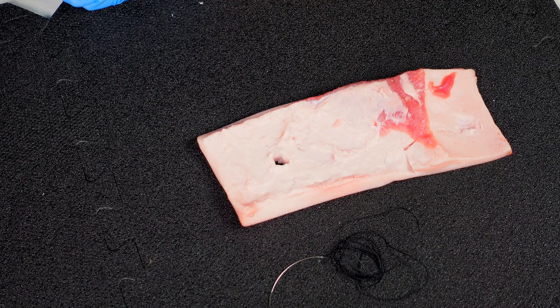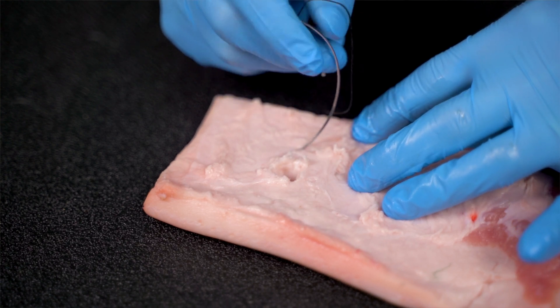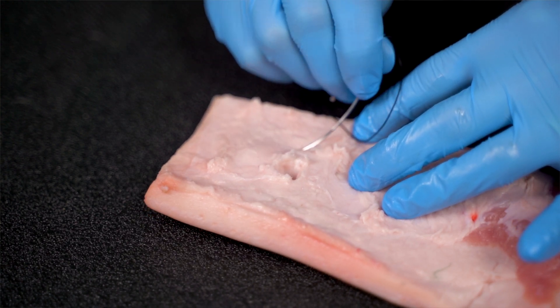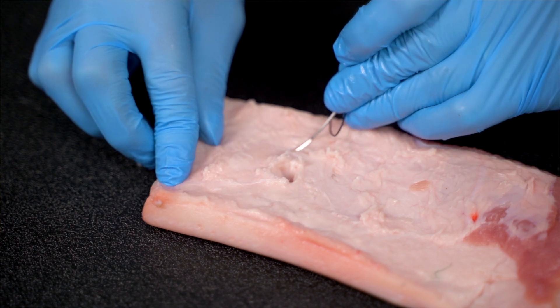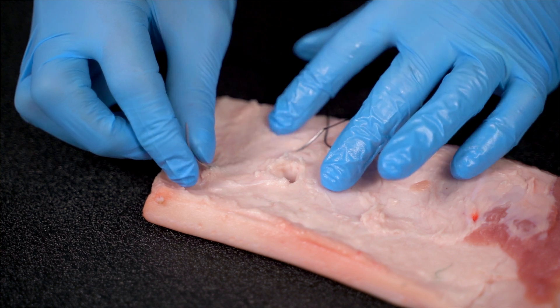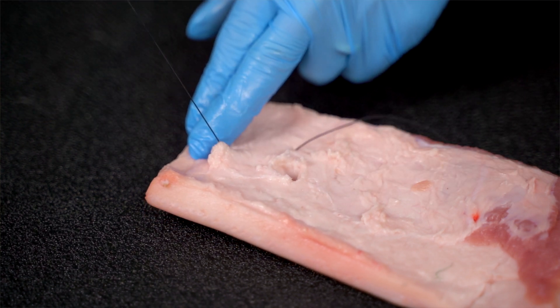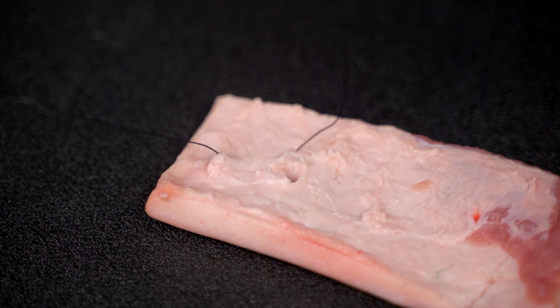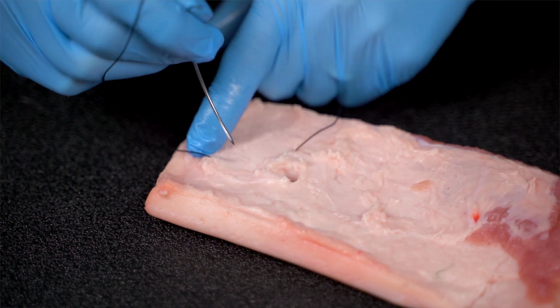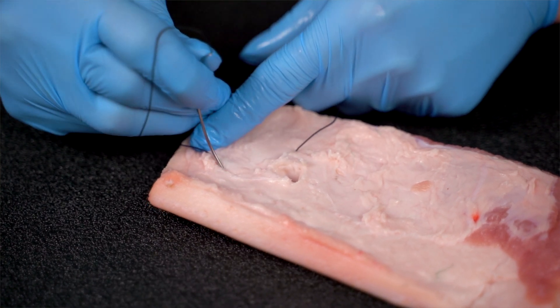Make sure your patient is appropriately comfortable and your wound is appropriately numb. The idea of this technique is to go around your wound in a systematic way, starting with a backhand suturing technique with your needle. It needs to be pointing the opposite way than you'd use for simple interrupted suturing, and you're following your path around the circumference of the wound. You'll see us take four bites to make our way around, but some wounds may require more or less as you see fit.